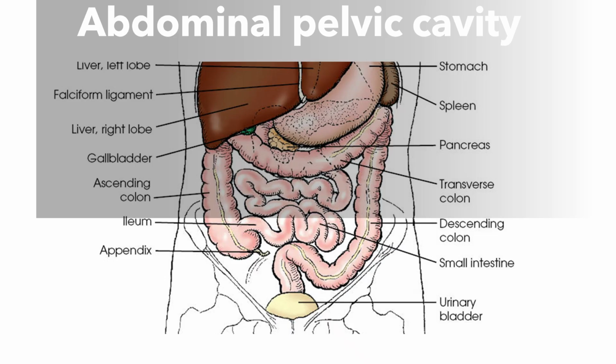All right. So large colon shows up because, again, the air bubbles in it show up, and it kind of frames the lower abdomen, so it's easy to recognize. A small bowel shouldn't have much air contents in it. I mean, you see occasional air bubbles in it, but it's like a mound of spaghetti, so it kind of shows up, but you can't really pick out individual structures. It is self-superimposing, and again, until you fill it with contrast, you don't really see the details of the small bowel well on a plain radiograph.